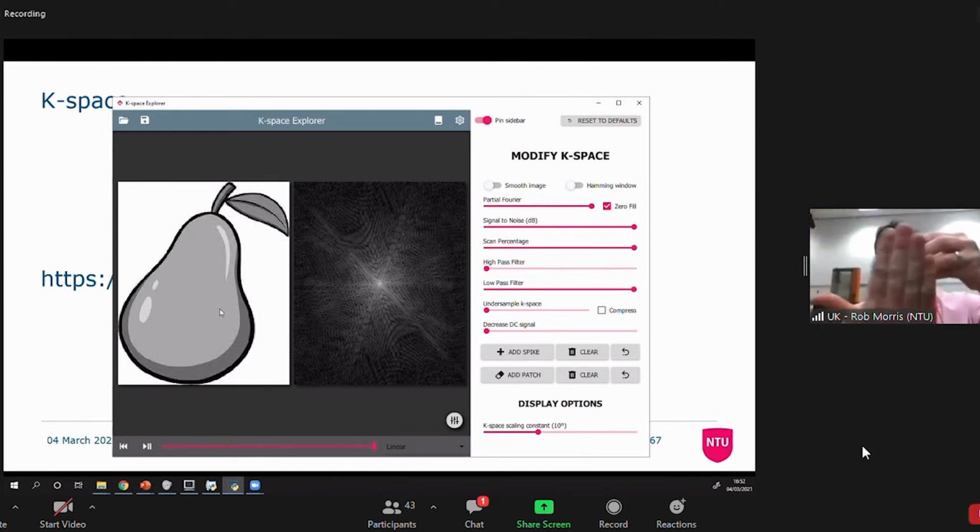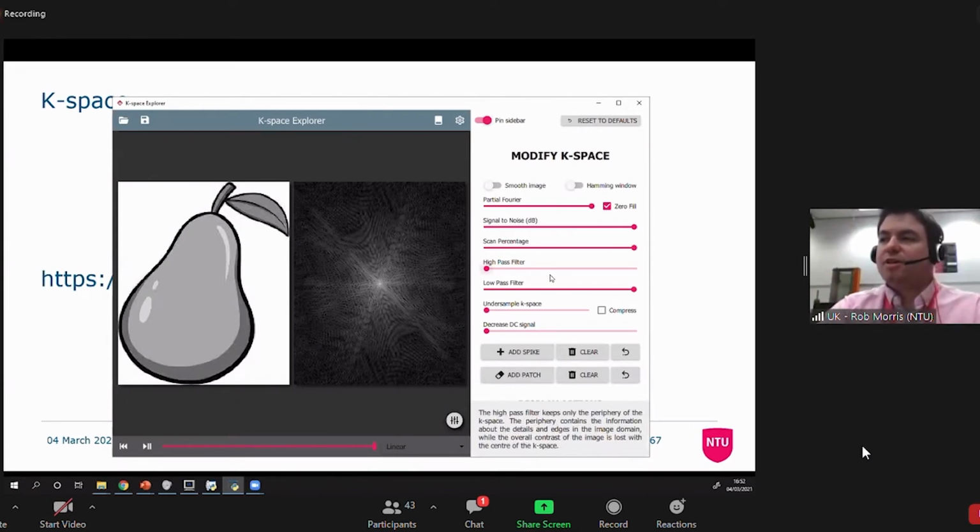Here, this would be what we would see for a cross-section like this. You see now we've got these details changing in every direction. Working from the middle of our image outwards, I see quite a few different colors through here, and I get a sudden sharp change at the edge, and a different change in this direction, and a different change in the other direction. So unlike our square, which was just a cross, because we only saw changes this way and this way, we now see this kind of pattern which goes everywhere across the image.